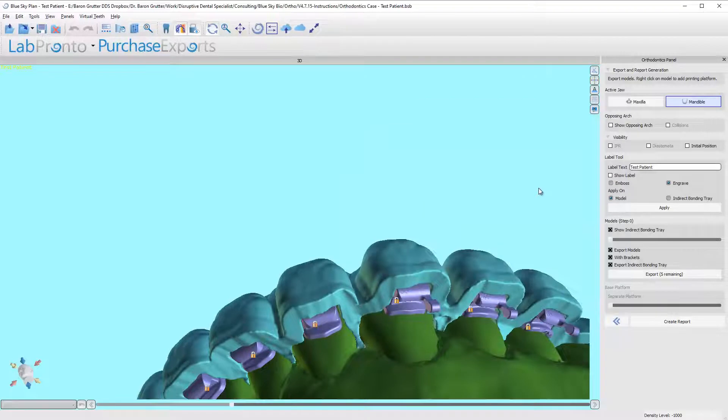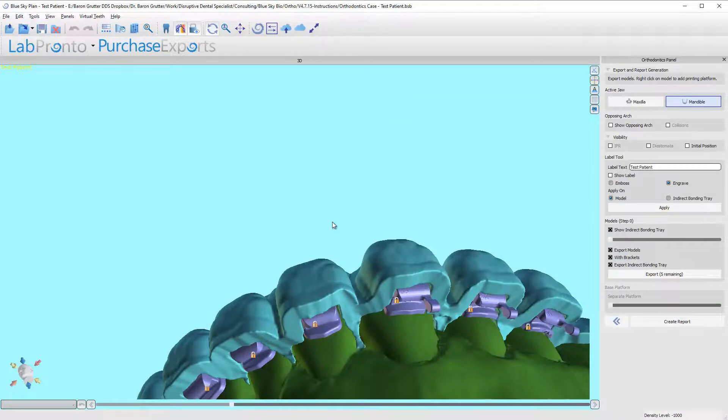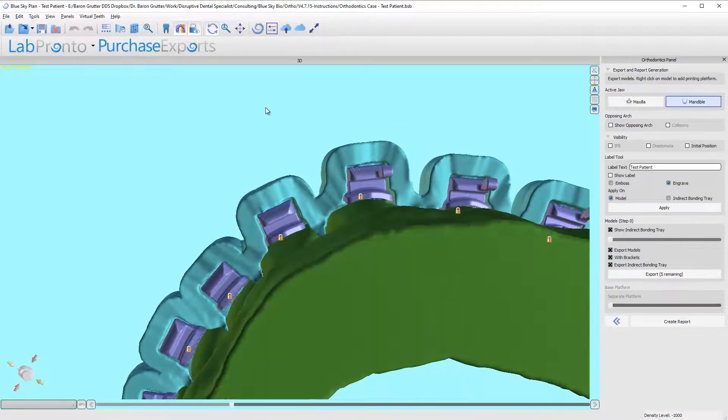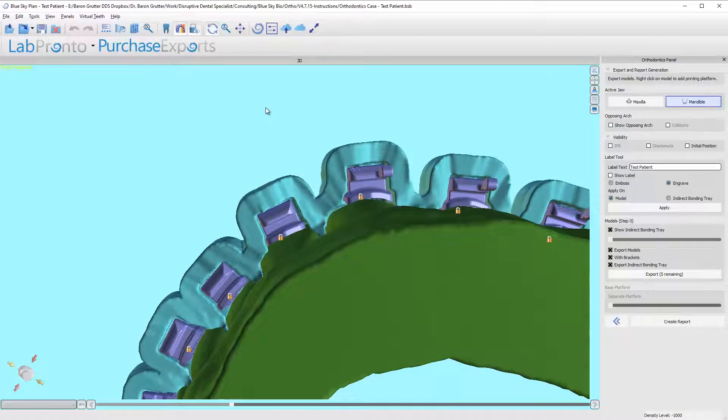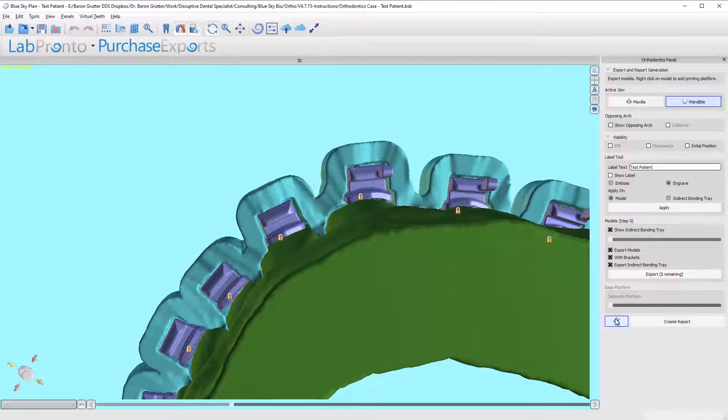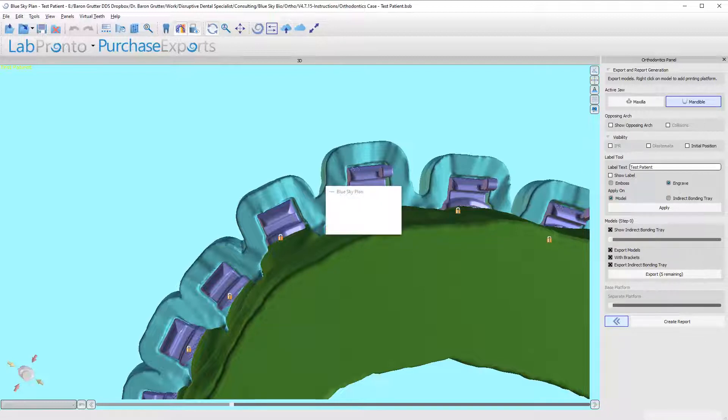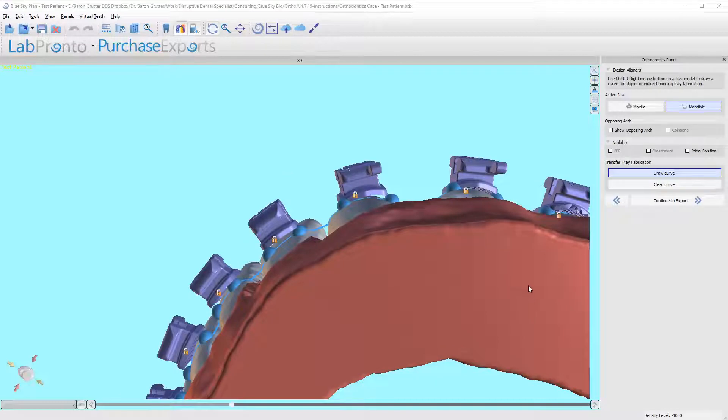So I'm gonna click okay and I'm gonna go ahead and go back and I'm gonna have the software redesign it. I want you to see the difference. All right, okay, so let's go back and now I'm just gonna go ahead and hit continue to export again.